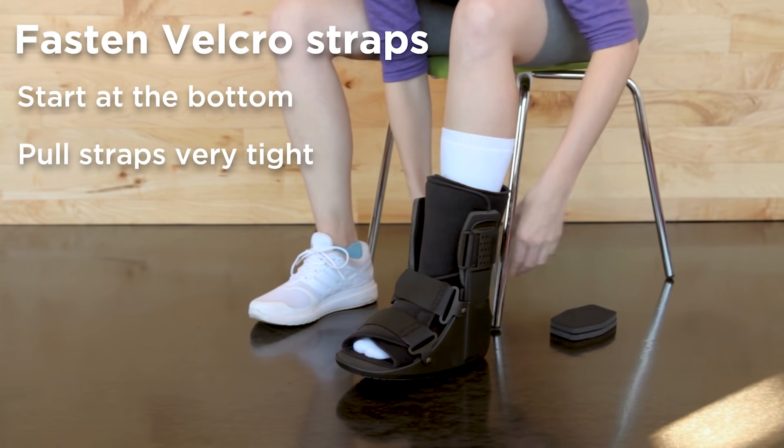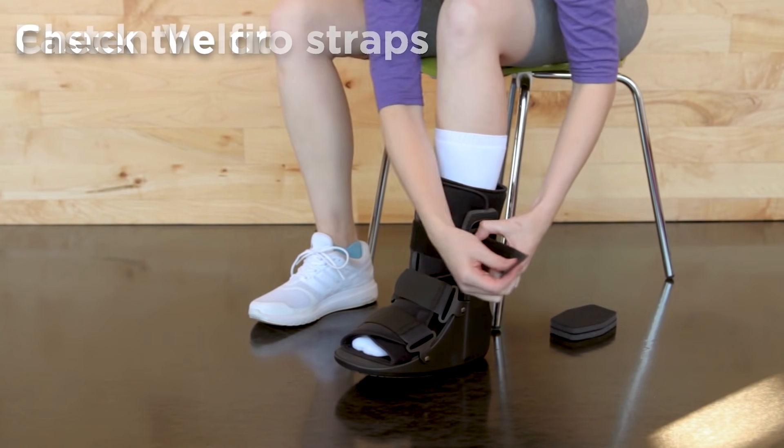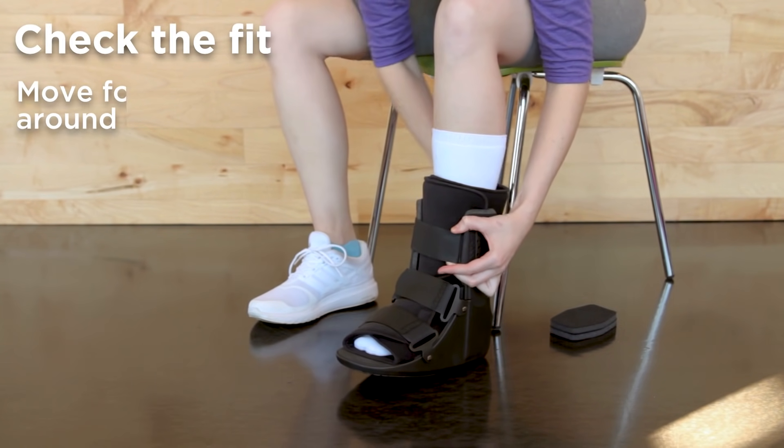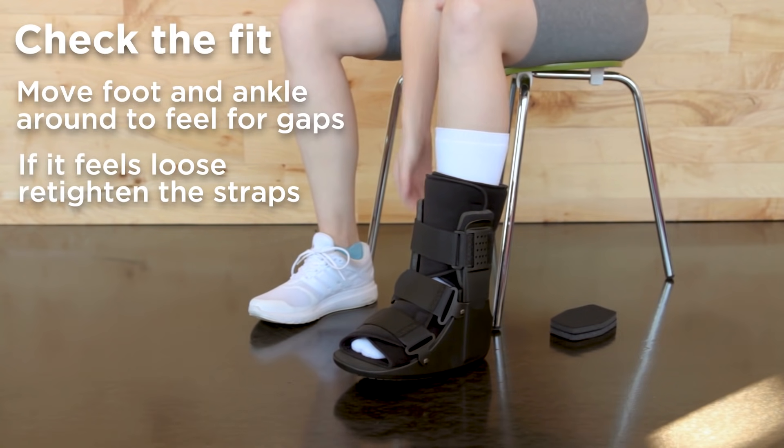Make sure that you pull the straps nice and tight so your foot doesn't slide around. If you experience any movement or feel like your heel is lifting when you walk, we recommend refastening the velcro straps.